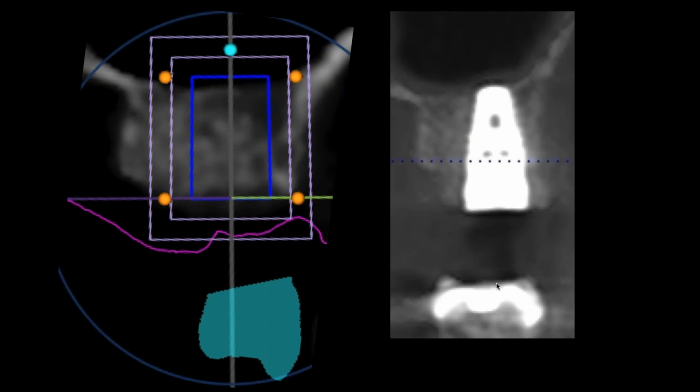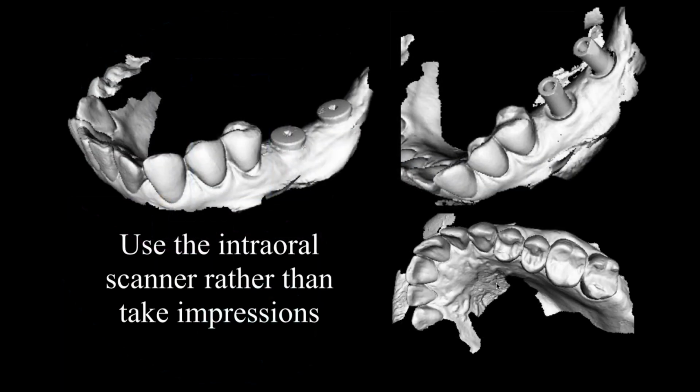So this is an easy way of doing this. It should work out fine for you. The other thing that I think is really important is scan bodies. So I saw a patient today, and the dentist says, "Can you do the scan body?" And I didn't know what lab he was using. So I didn't have the scan body for that particular lab.